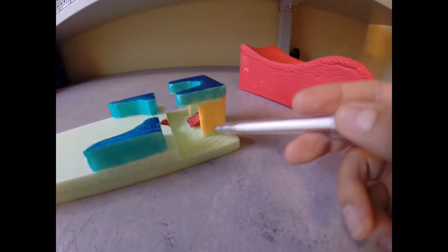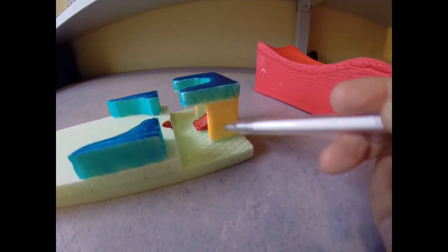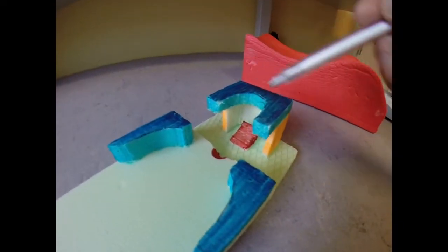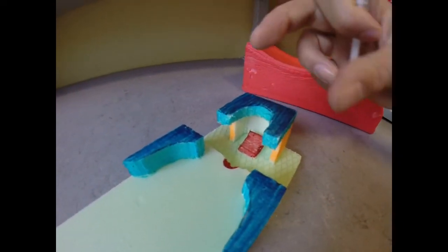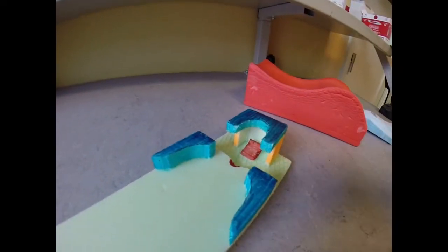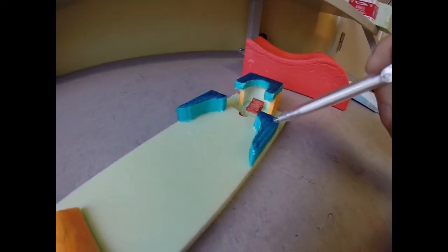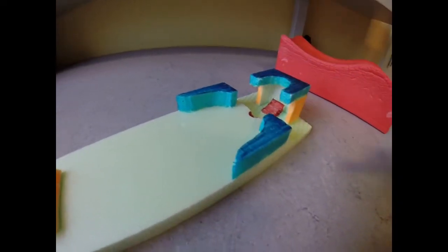I colored it orange and blue - this was to support the head and to prevent a rotation of the head. And this was to align the shoulders, to make sure the shoulders were in the same position.